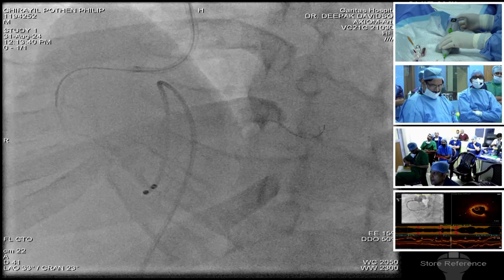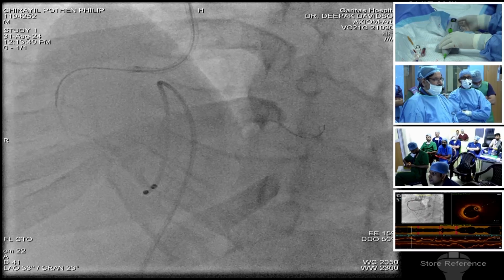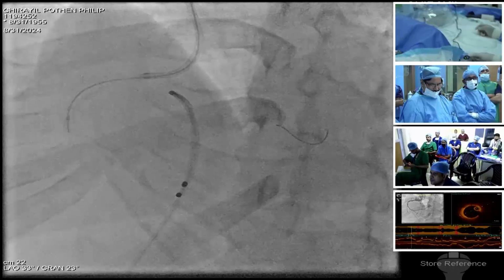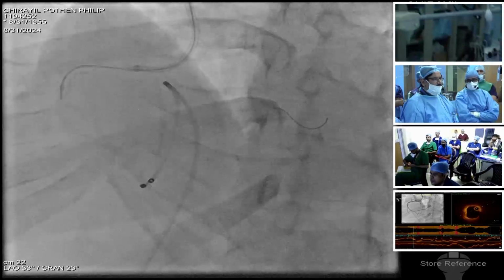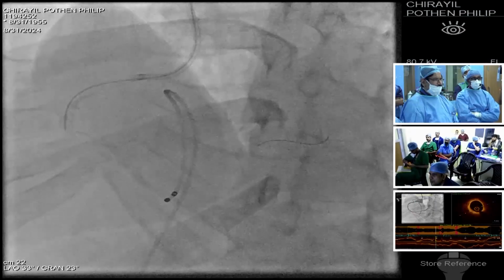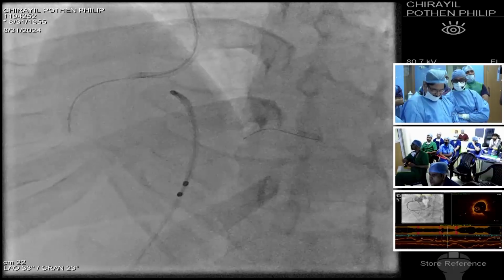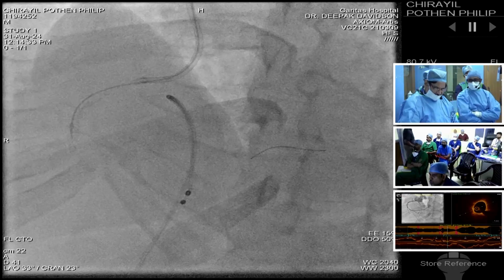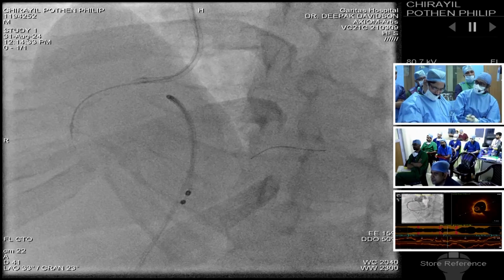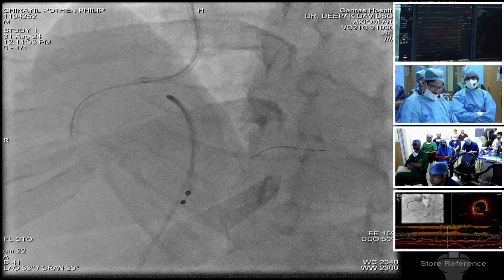In one of the picture-in-picture, can you show the hemodynamics also if possible? Just pulling the wire. Probably we can pull it back by around 2 to 3 centimeters. Yeah. Yes, that's all. Then 120 I can change. Okay. What we do is retrograde also we do it at 80,000. Then once again go in with 120,000. Okay. We can do 80. Yeah.